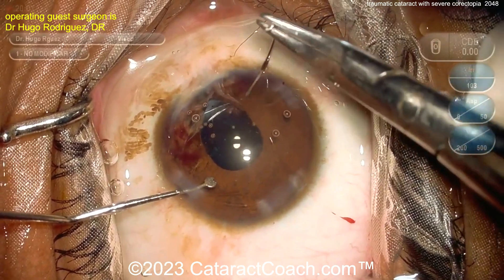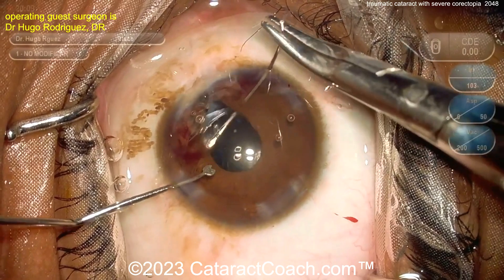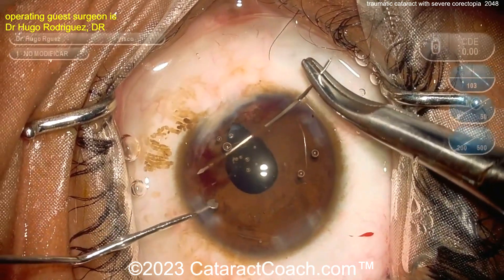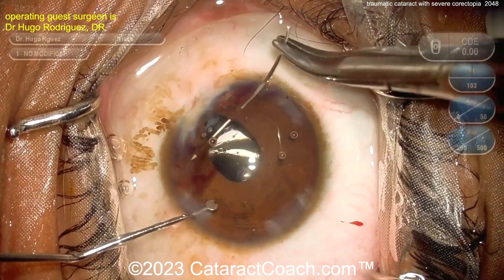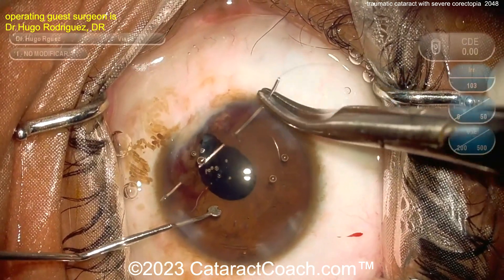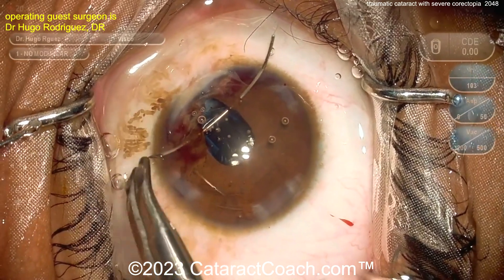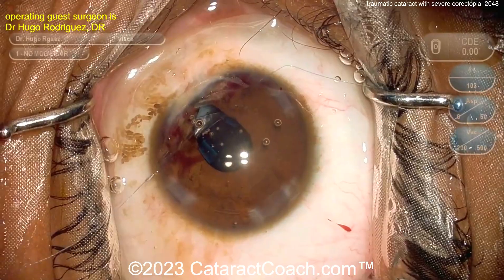Now going in with suture material. The commonly used suture is 10-0 prolene, sometimes 9-0 prolene, but you want it on a longer needle to get across the anterior chamber. Start by going through a paracentesis, then coming through and either poking through the cornea or exiting another paracentesis — however you prefer. The suture is being pulled through.